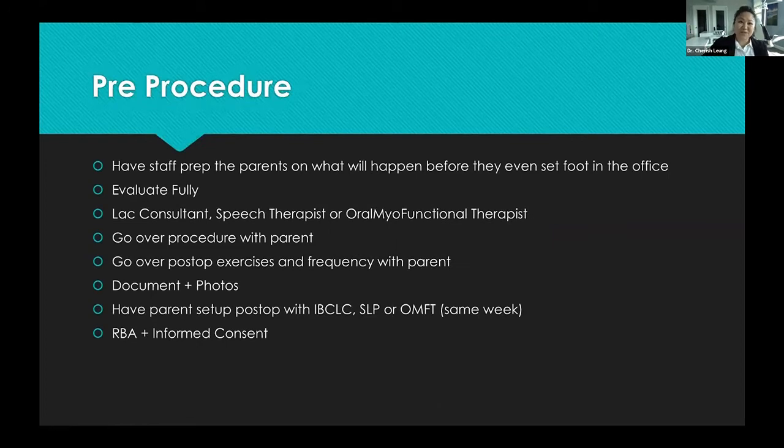So what do I do? So pre-procedure, I have the staff prep the parents on what's going to happen. So these are mostly for our patients who are calling and saying, my kid has a tongue tie, I need to come in, I need to treat it, especially for our new moms. So I have the staff prep them. I let them know, when you come in, we're going to do an evaluation. If you want to do the procedure the same day, this is what's going to happen, X, Y, Z. And we'll go over that.